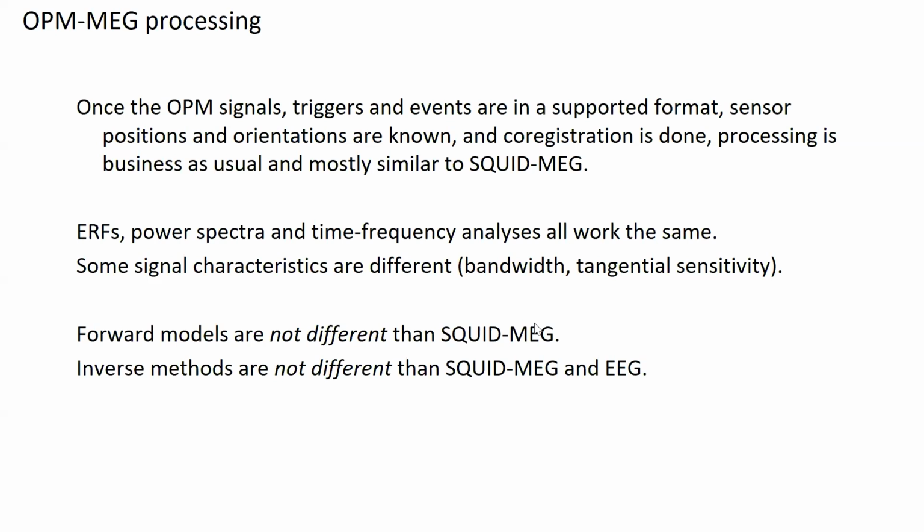And it's also important to realize that forward models are not different between OPM MEG and SQUID-based MEG. So all of the techniques that have already been implemented can simply be used for OPM MEG. And also inverse methods are not different between OPM MEG and SQUID MEG. Actually, they're also not different than EEG.